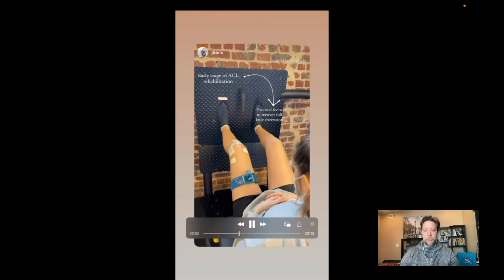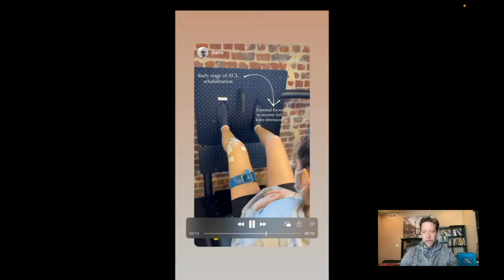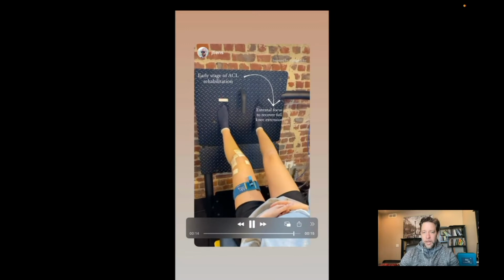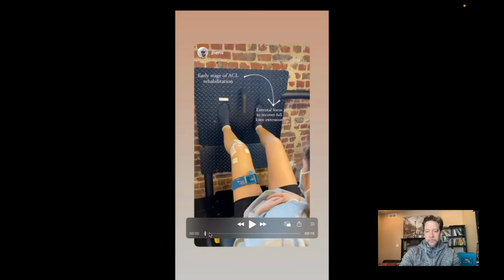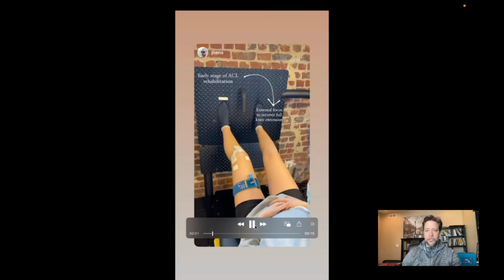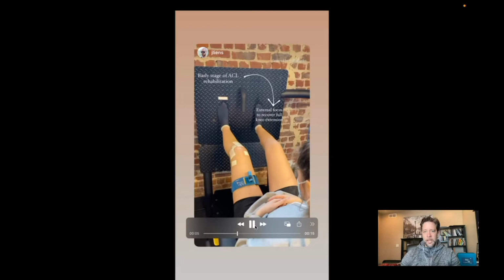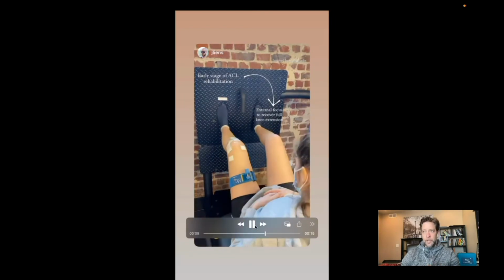And she was just struggling to get that quad to fire through a larger range of motion. So this is motivating for her to get that all the way down there, tighten up her quad. The only way that laser is going to move down there through terminal knee extension, we'll play that again, is to go through extension at the knee. All right. And as he's mentioning here, an external focus of attention. So that's in the motivation piece.